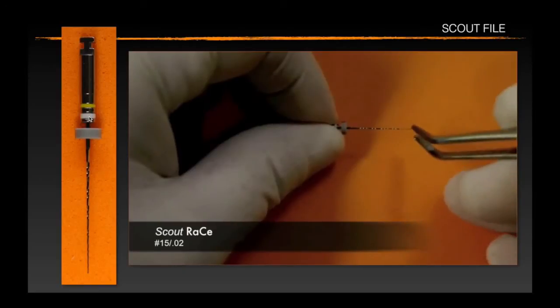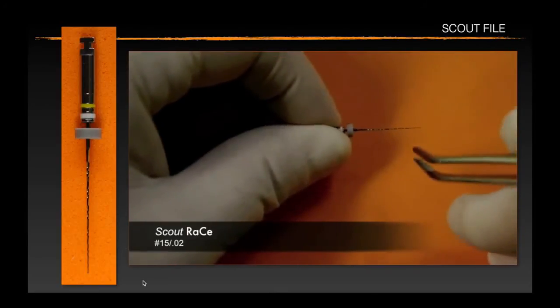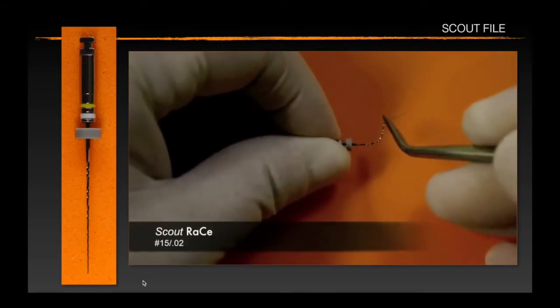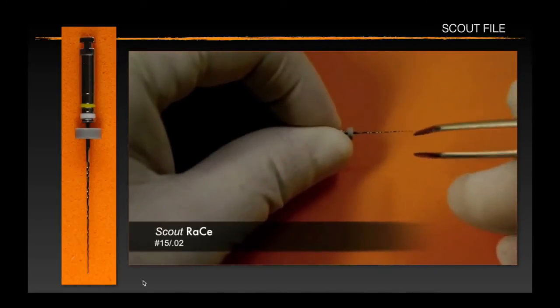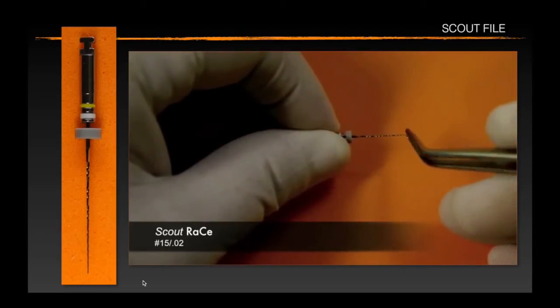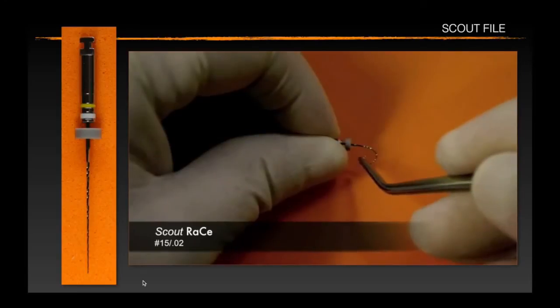A couple of years ago I bumped into this instrument here. This is a 1502 nickel titanium file. It's made by our friends at Brassler USA. They came up with this idea of having this extremely flexible instrument.